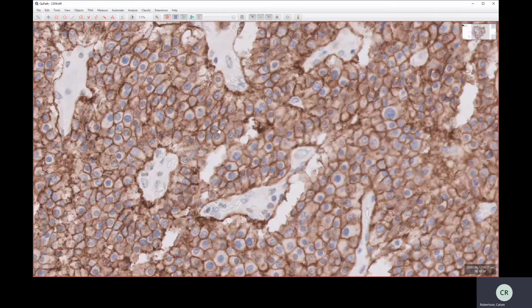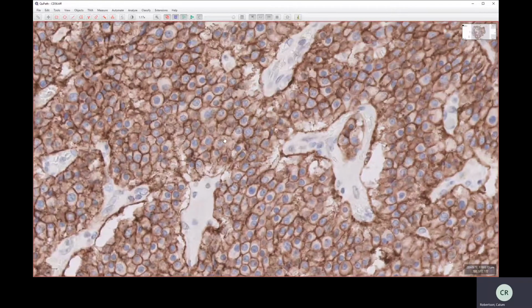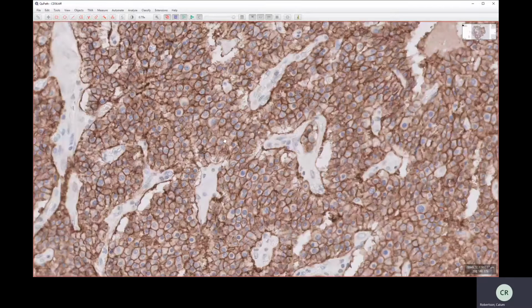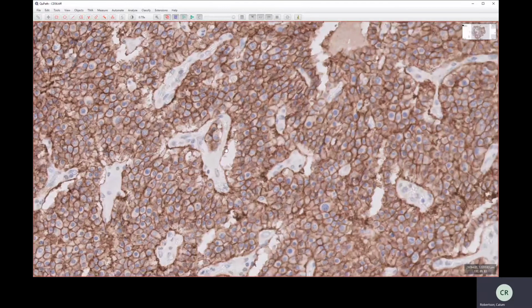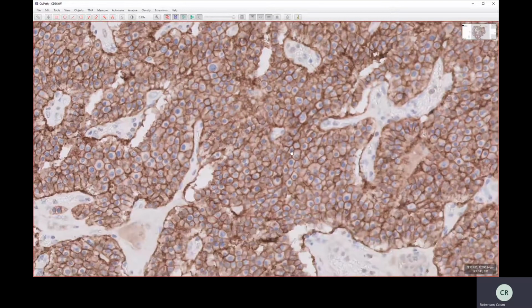And we can grade the positivity in different ways and in different parts of the body. Sometimes it's a bit vaguer, but in other situations, for example in the breast where we have Allred scoring, we've got a very clearly defined grading system based on how well it's staining. But this is strong membranous staining here. This is really clear membranous staining. So that's an example of membranous staining.